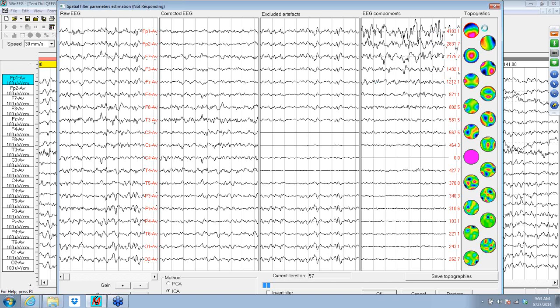The chunk of EEG was complex, so it's taking its time, but we'll see the results here in just a moment. The topographies will all shift, and again, these real spotty images will end up disappearing.